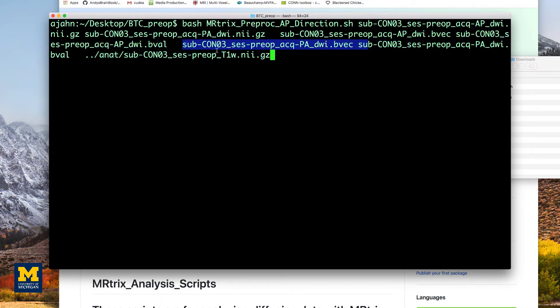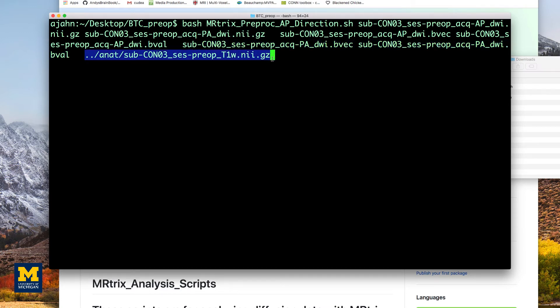And the last argument is the anatomical image, right here. These arguments will populate the variables in the rest of the script, which is essentially a collation of all the commands that we use in the previous chapters.